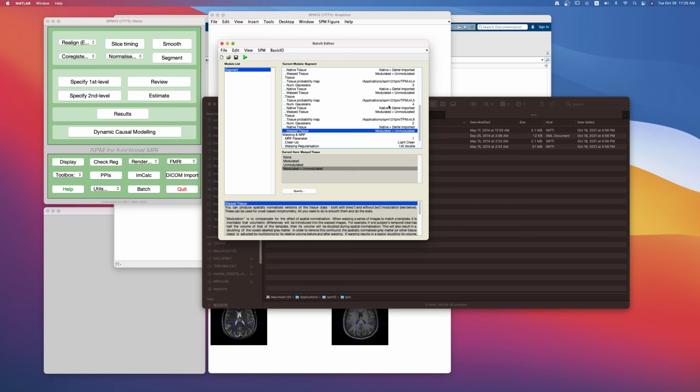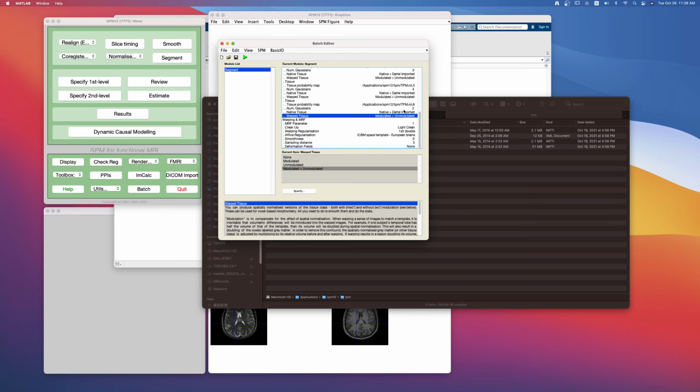You don't need to recompute anything, all right? And in fact, it simplifies the calculation a lot. So this segment step is one way to do the normalization using a deformation procedure where you change shapes. There are many ways to do this. This is just a way that is adopted in SPM and also in some other programs as well.